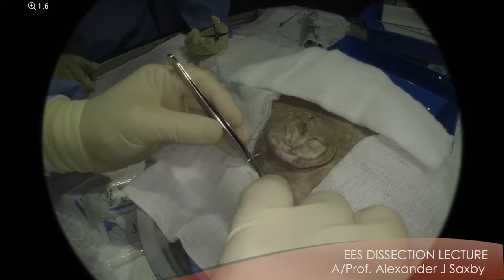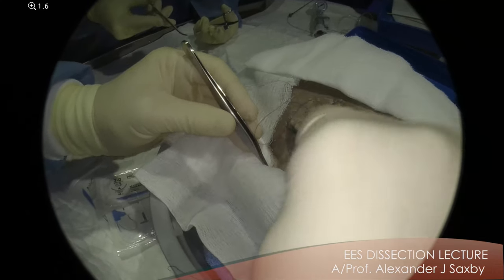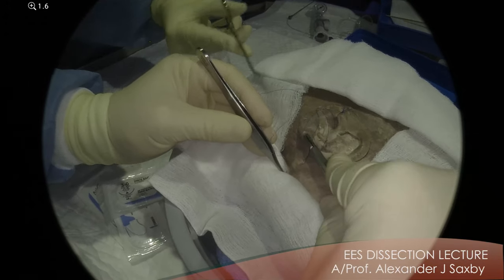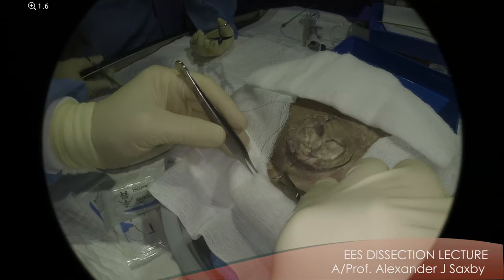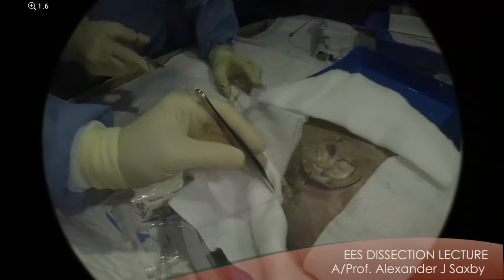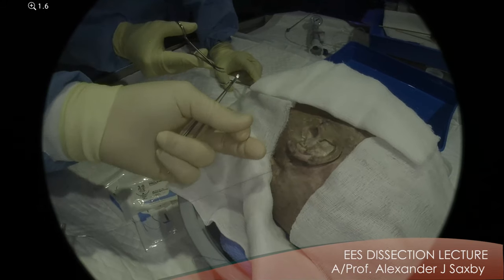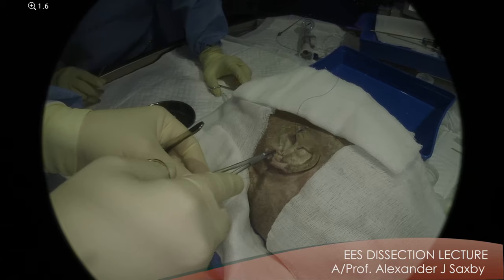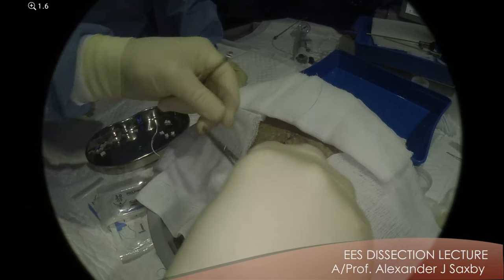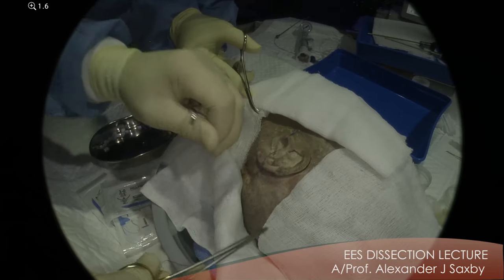And they may seem like insignificant steps, but every little step, like a stapes procedure, makes a huge difference. The danger of using the suture rather than the lone star is that you can cheese wire the conchal cartilage. So you need, in real life, to put a gauze under here.